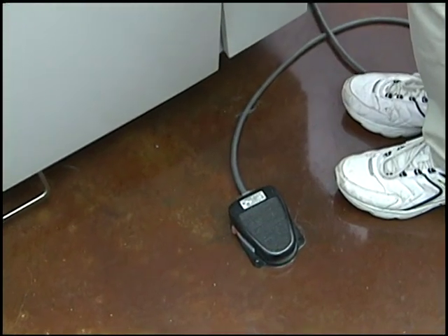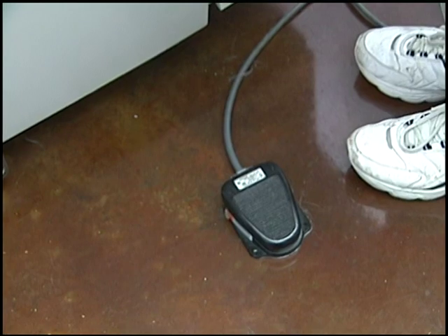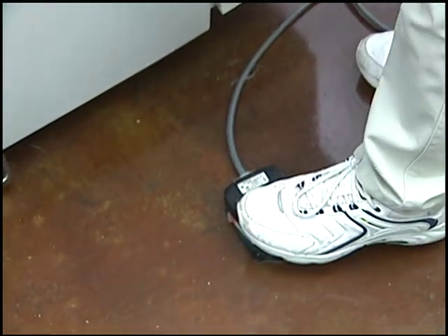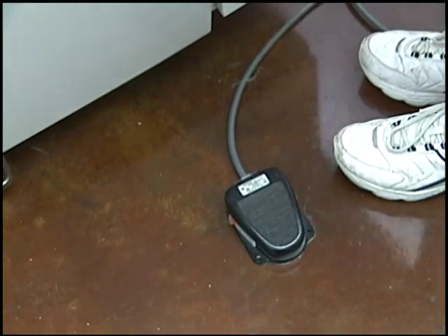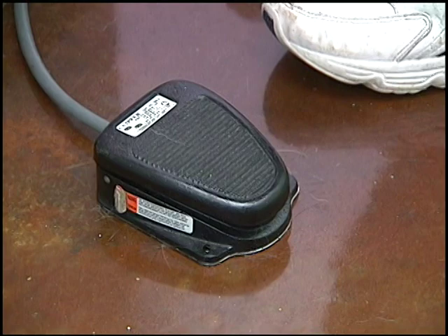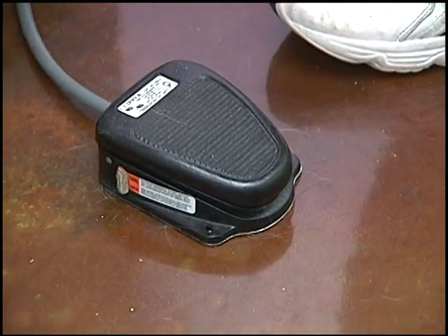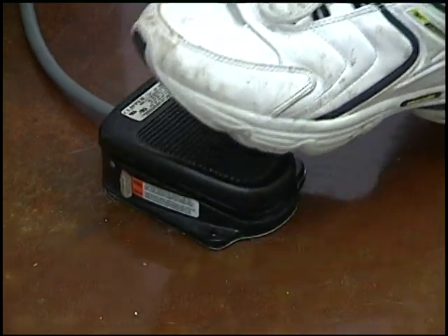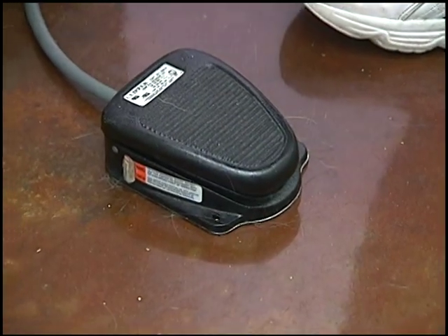With the patient being held as still as possible, expose the film by pressing the exposure button or foot pedal. Most foot pedals are two-stage switches. The first depression or partial depression activates the rotor. You'll hear a motor running in the tube in this prep stage. A second depression of the pedal will actually create the exposure. The actual exposure is generally indicated by a tone or beep.